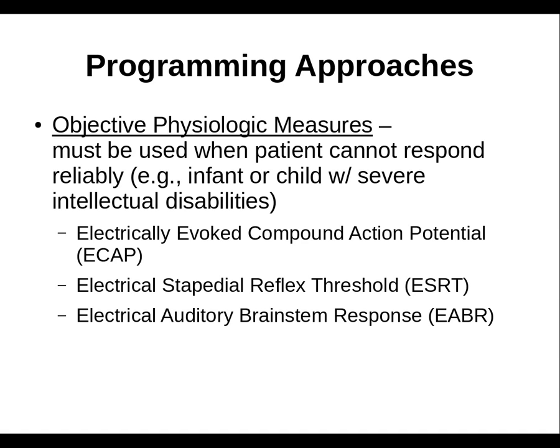We can look at first some electrophysiologic measures or electroacoustic measures. We have the compound action potential, but it's electrically evoked. That's similar to the compound action potential we measure with electrocochleography.